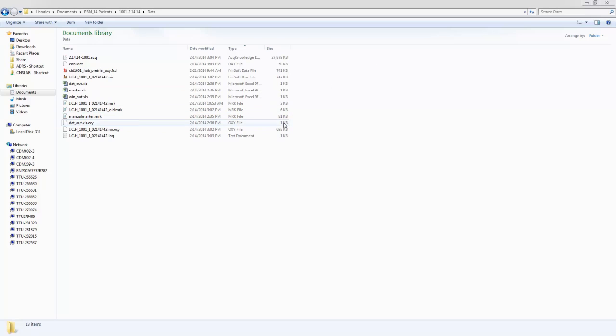Okay, this video is going to show you how to process the fNIR data. The assumption is that you've already cleaned your marker files, and we may do another video talking about how you can clean up the various elements.